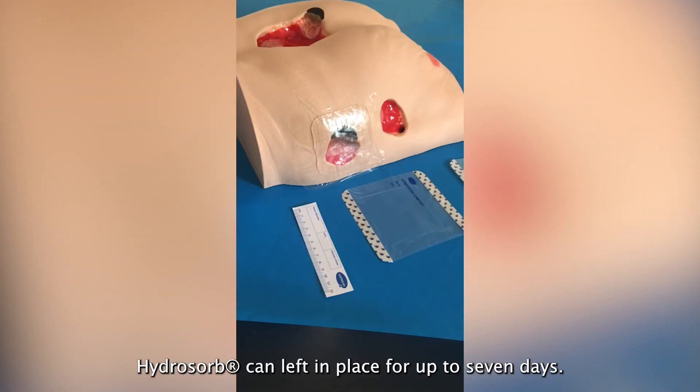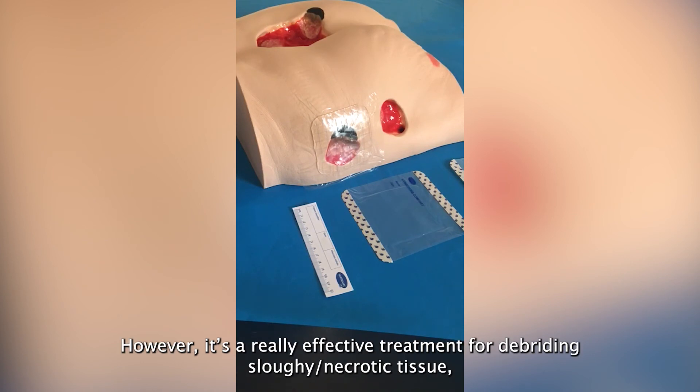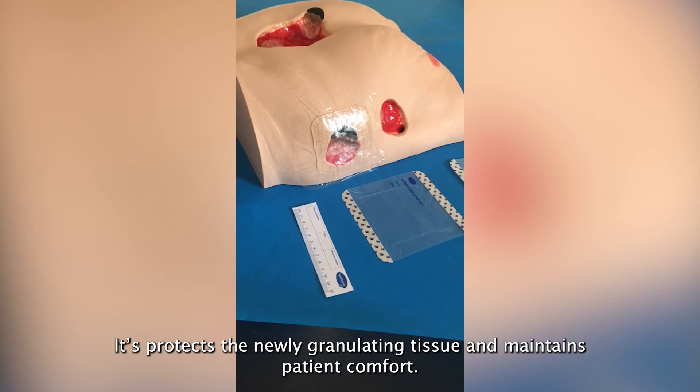HydroSorb can be left in place for up to 7 days. It is not indicated for clinically infected wounds or 3rd degree burns. However, it is a really effective treatment for debriding sloughy necrotic tissue, especially when surgery isn't an option. It protects the newly granulating tissue and maintains patient comfort.